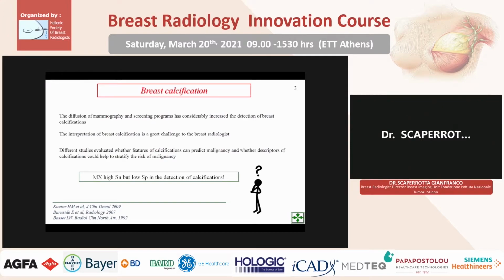In the literature, there are many studies that evaluate whether there are features of calcifications that can predict malignancy, and there are some descriptors that can help us to stratify the risk, because mammography has a high sensitivity, we know, but the detection is difficult and the specificity is low.